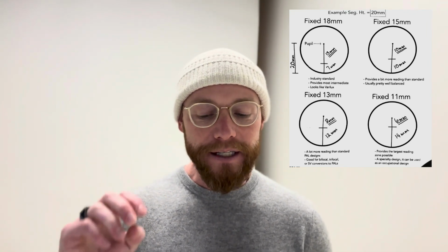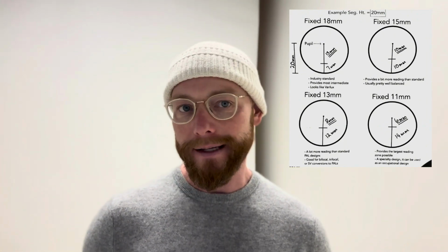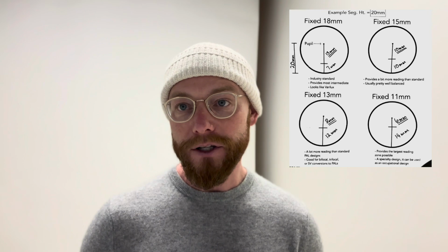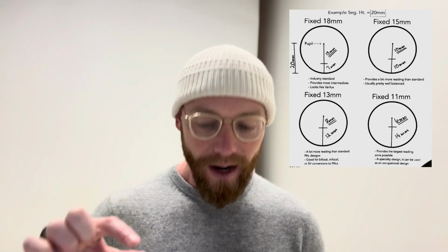Then the third option is fixed 13. This is a lot more reading. We're getting into more of a similar to a bifocal or a trifocal design. Now, obviously it doesn't have the lines or anything like that, but you're getting a little bit more room in that reading instead of in the computer. So this is for that person that says, hey, I'm really not on the computer that much, and I really want to have that really wide in the reading zone.